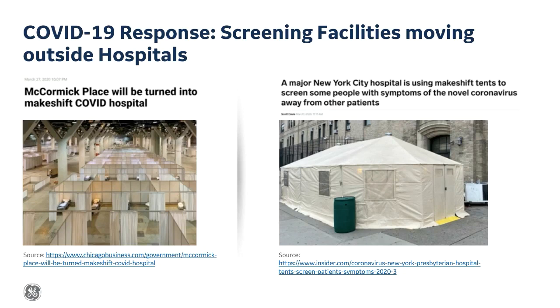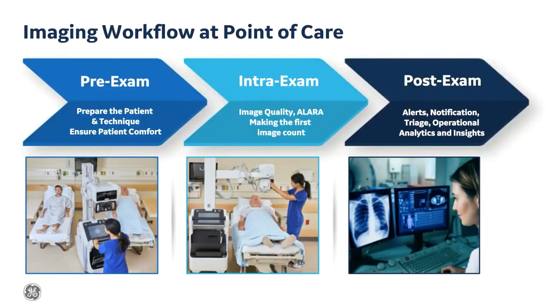Having understood this, let's look at a typical imaging workflow at the point of care. We could typically divide that into pre-exam or pre-scan, intra-exam, and post-exam. Now, this is a highly manual and complicated process.